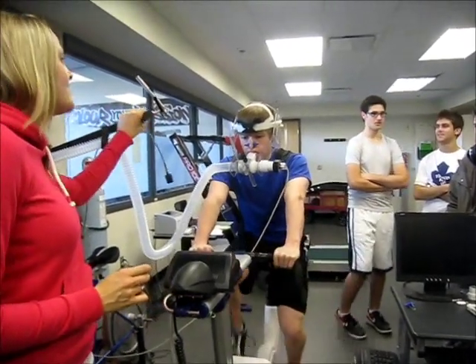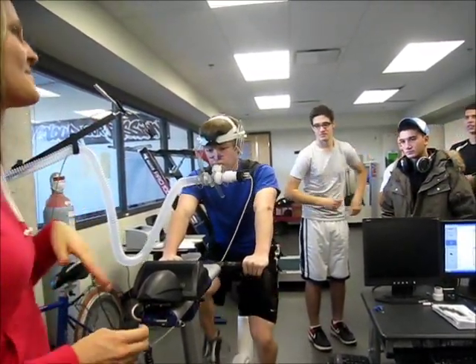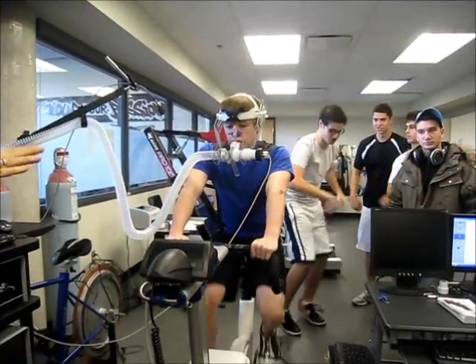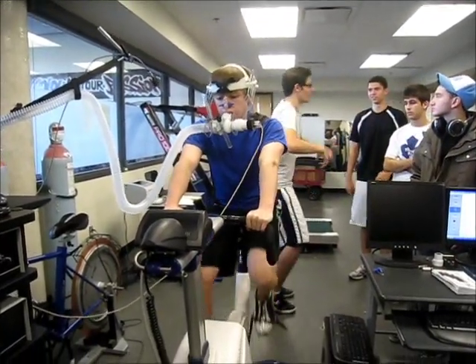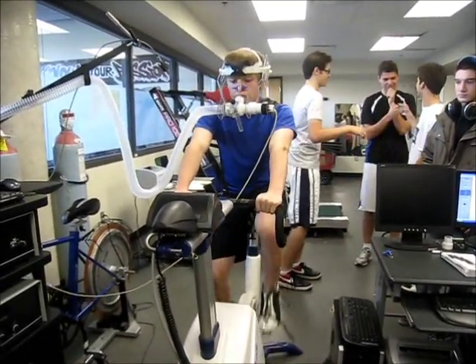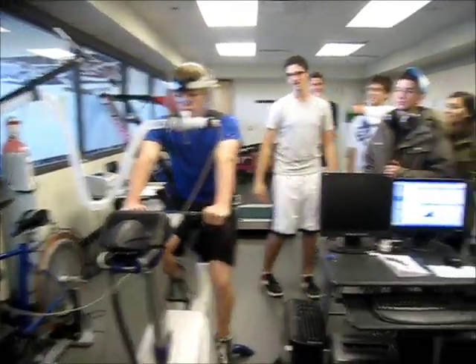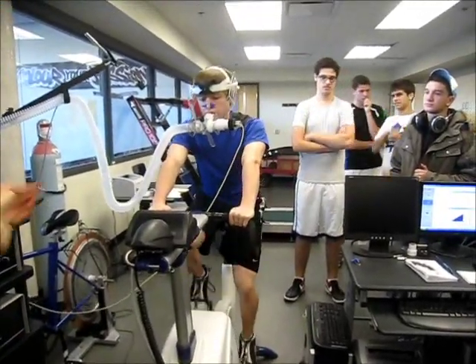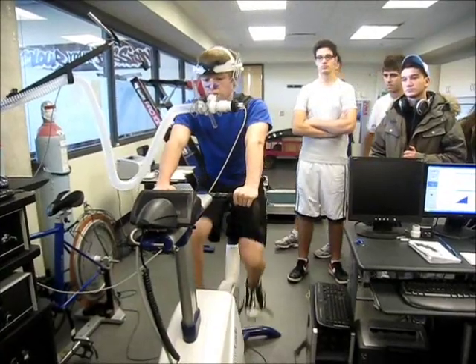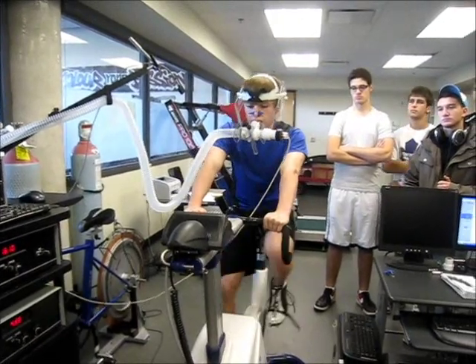If you want to get a little bit more power you can come off the seat, but for the Wingate test your bum has to be on the seat at all times. Heart rate is not being recorded there — it can be measured on this one. This is a heart rate monitor. It's monitoring his heart rate and it goes through a wireless signal and we're able to pick it up on the computer. It's actually this right here that's detecting his heart rate from the strap he's wearing, and then we get the value from the computer.